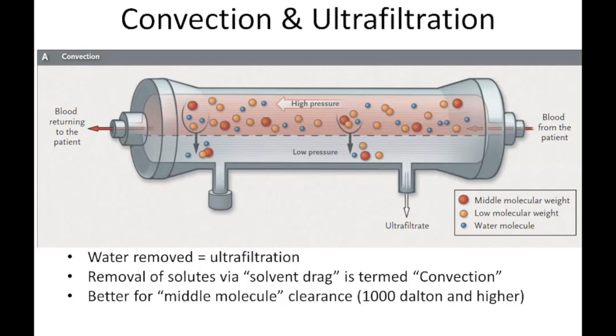too as well. So as we pull fluid across this barrier, it will drag not only the small molecules, which are classic urea clearance that we talk about in regular hemodialysis, but it also pulls middle molecules through there. And these are protein-sized molecules, things like cytokines. And so there's some thought that that might be helpful in conditions like sepsis where you get cytokine storms and those things. And we'll come back to how that may or may not relate to COVID.